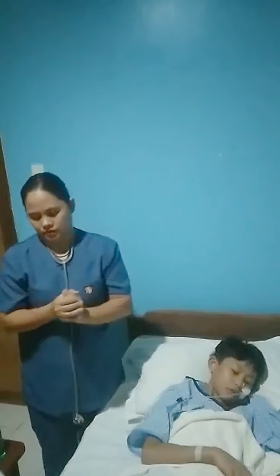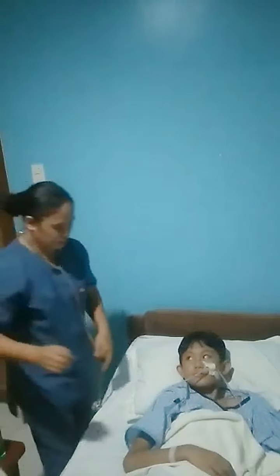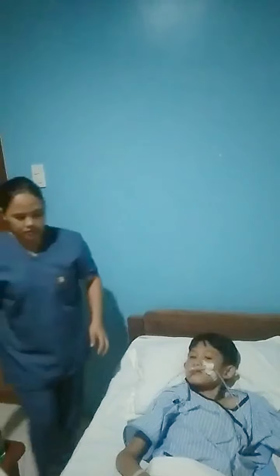Do aftercare. Return all the materials used. For evaluation, we need to return to the patient after approximately 30 minutes.